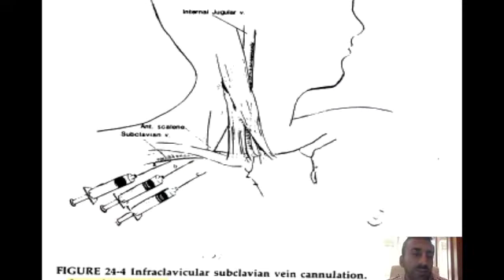This cartoon shows the potential of other avenues of approach, and I'd like to highlight again the lateral approach when we use ultrasound. And in the end of this talk, we'll go on to the demonstration, and I'll demonstrate to you the potential utility of ultrasound to allow us to have our needle approach much more laterally than the traditional areas of access.